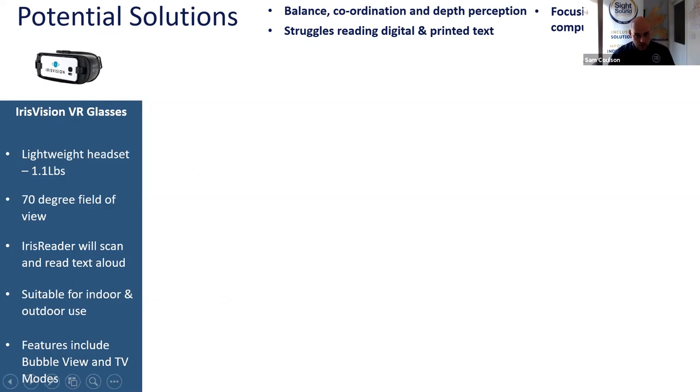Essentially, this is similar to virtual reality in a way. So you have no peripheral vision with this one. Everything functions through the headset and through the actual phone itself. But this has many different features which may be of use.